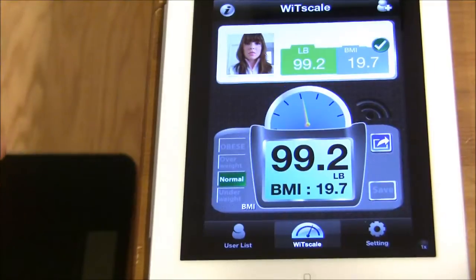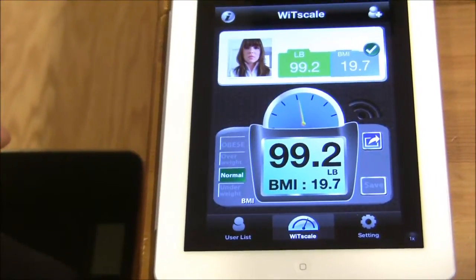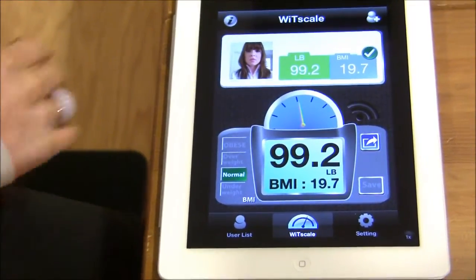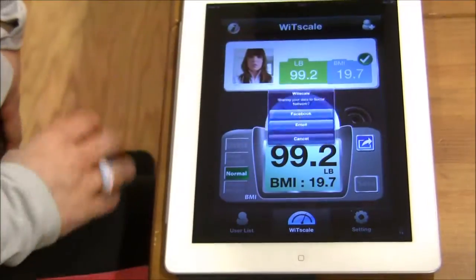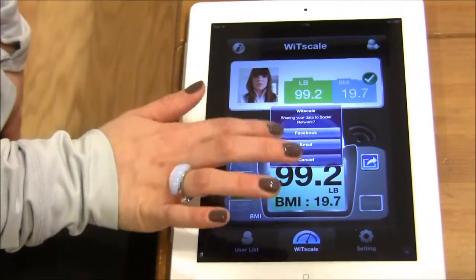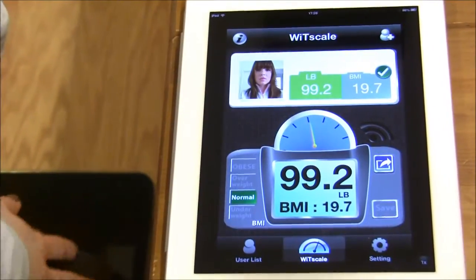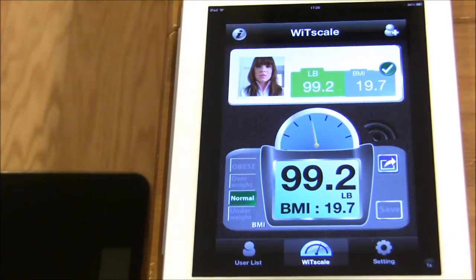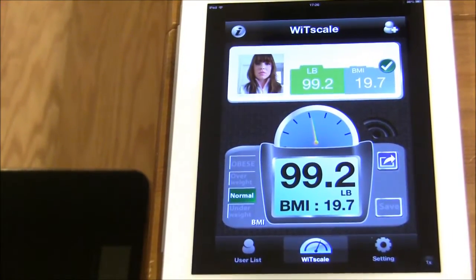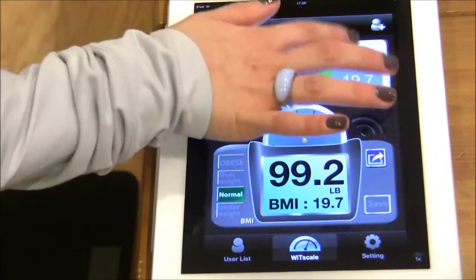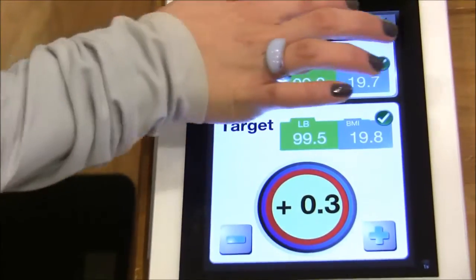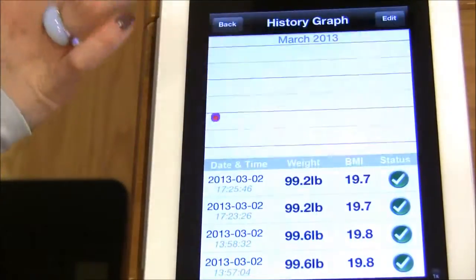If you would like to share this information with friends, you may do so via Facebook or email. In addition, if you would like to track the goals of your weight, you may do so using this graph.